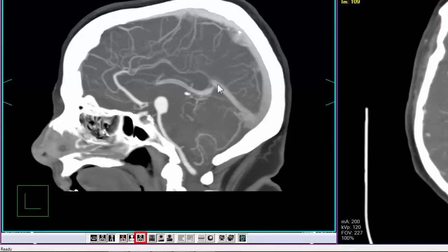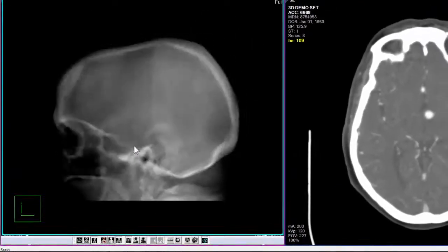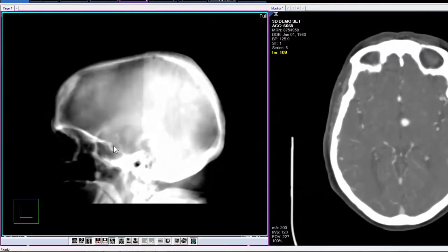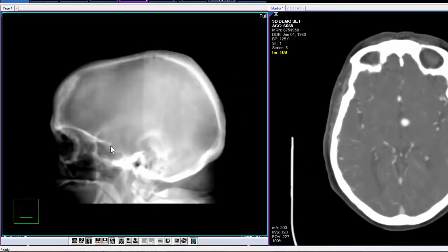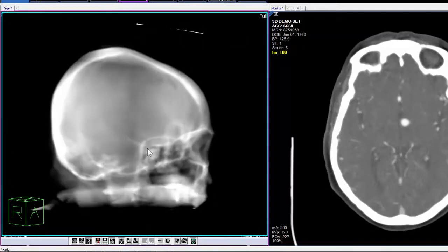This is the RaySum Average Projection icon. Its keyboard shortcut is the letter V. RaySum Average displays the data as an average intensity projection.